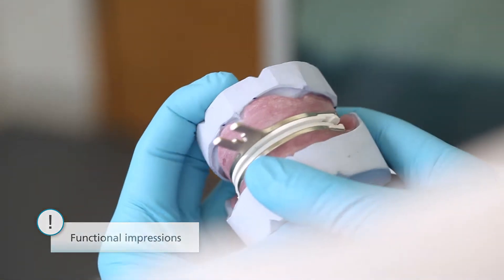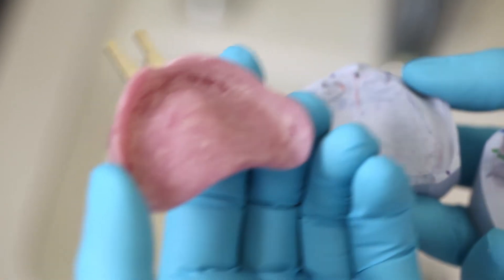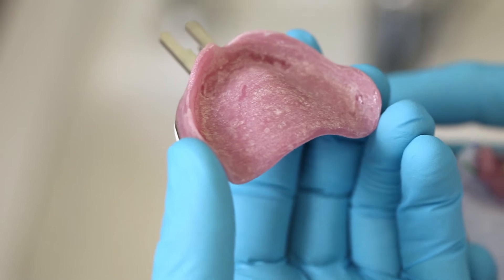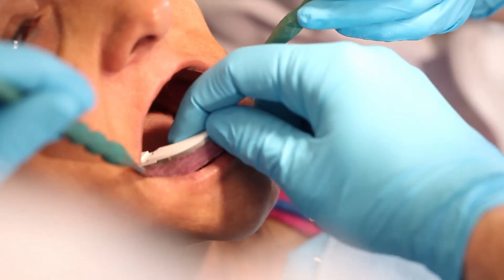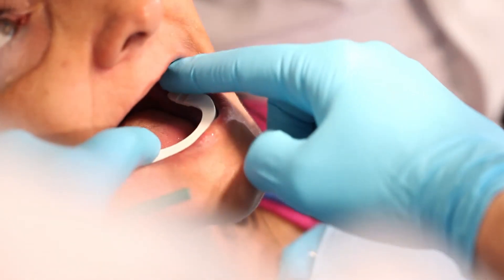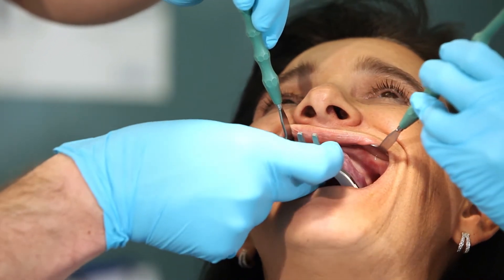Check the custom tray created by the dental lab. Make sure that there is enough space to accommodate the lip and the cheek frenulum. When the patient closes her mouth, make sure that the bite plates close in a parallel and flat position. The patient should not feel any pain in the process.